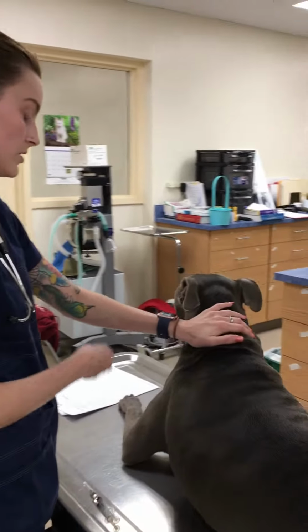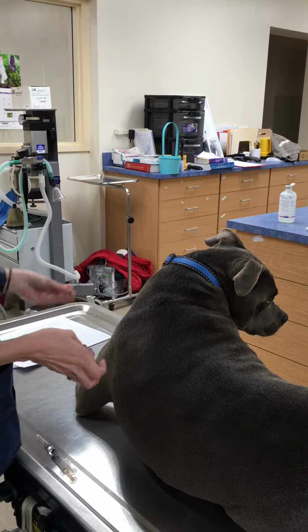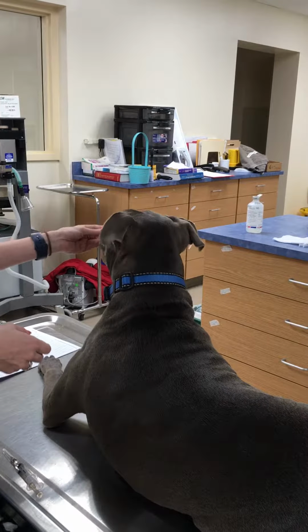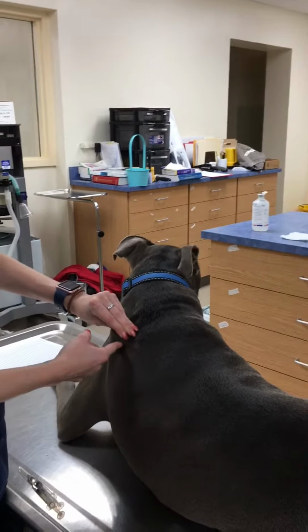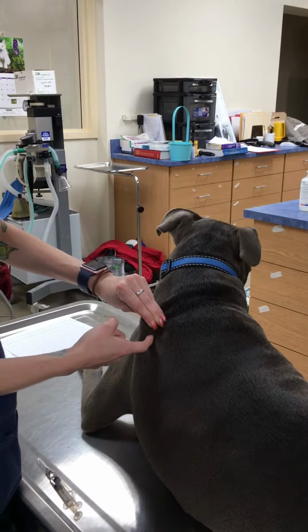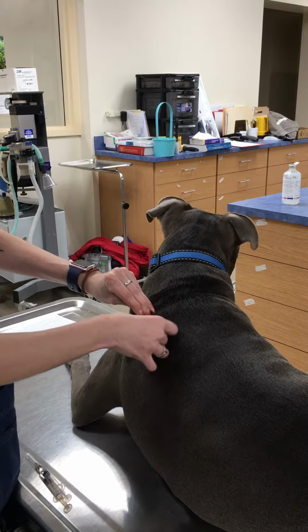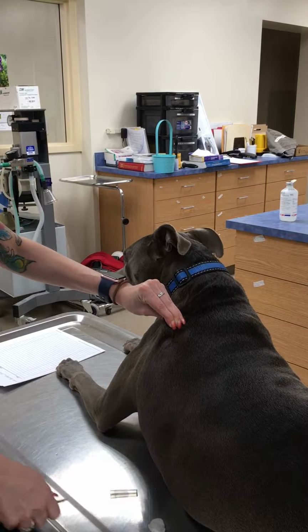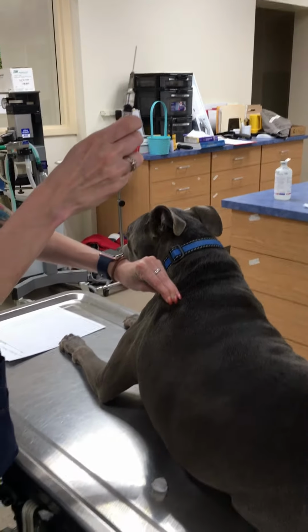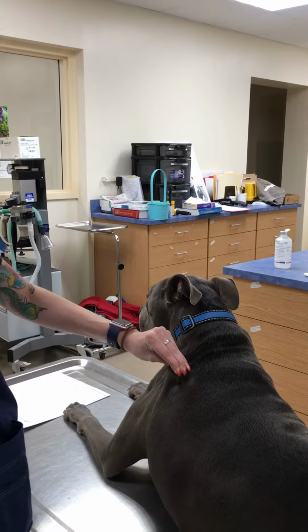So to begin, as previously stated, China's a very good dog, so she just lays here. China. And so simply, I would just tent the skin. I like to use my finger to make sure I have the tent in the skin correct. This is just some alcohol and some cotton that I like to disinfect the skin with. I don't touch the needle, and I always make sure that my bubbles are out of my syringe before doing it.